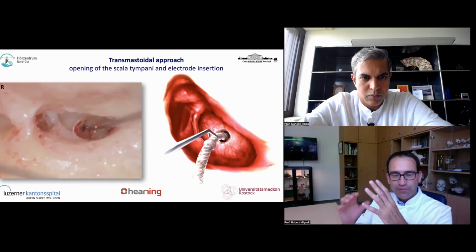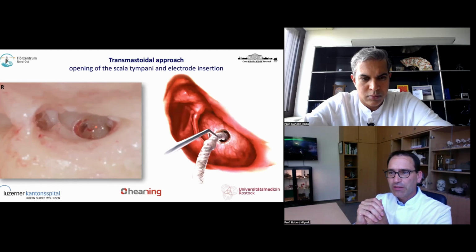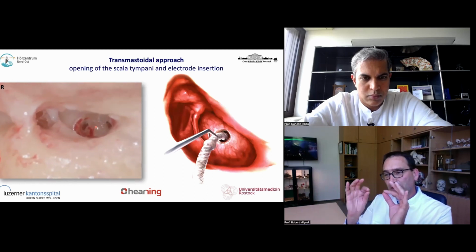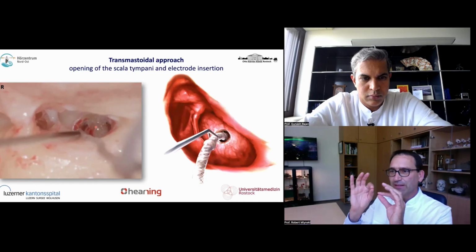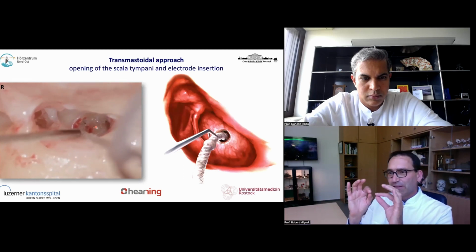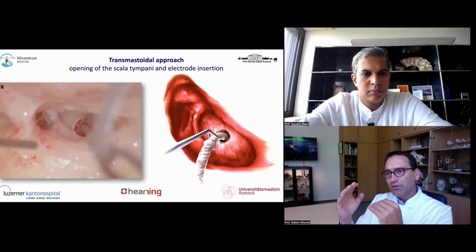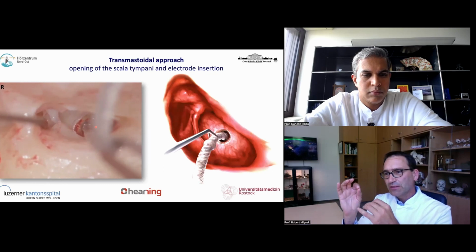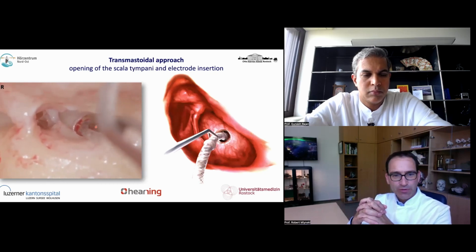It should be open, because the electrode is getting a little bigger over further insertion. Then you must also keep in mind that the electrode, at the openings of the metal contacts, has a little step around it. And if you have any bony bit, or if the membrane is too tight, it sticks in and you cannot continue further.